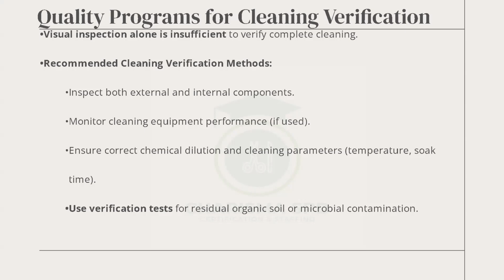It will also tell you how many liters or milliliters of water and of the chemical you have to mix, so that it will break down the fatty tissues and the debris. Use verification tests for residual organic soil and microbial contamination. Yes, we call this Sonicheck. In some places that's what they call it, Sonicheck.